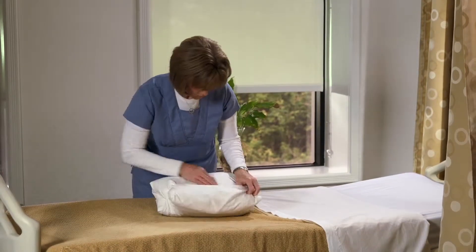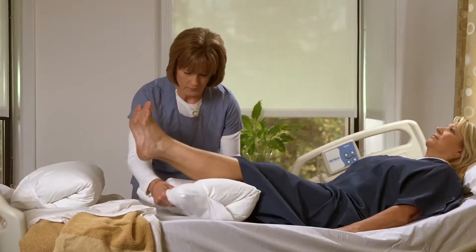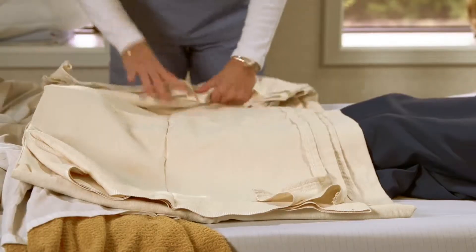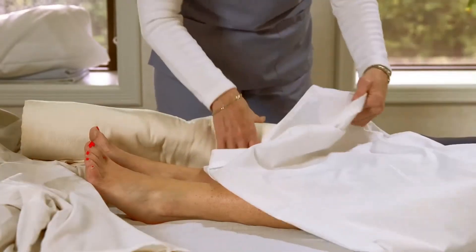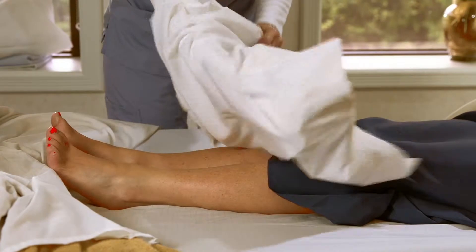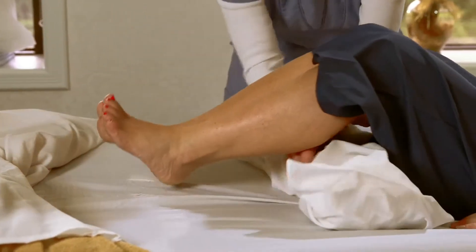This wedge can be used for positioning behind the back, sacrum, buttocks when turning from side to side, floating the heels, behind the head, under the patient's arms, or to help keep the patient properly positioned. If you use wedges for positioning, place the foam wedge or rolled bath blanket inside the Dermatherapy pillowcase. The goal is to keep the therapeutic Dermatherapy touching the patient's skin as much as possible.